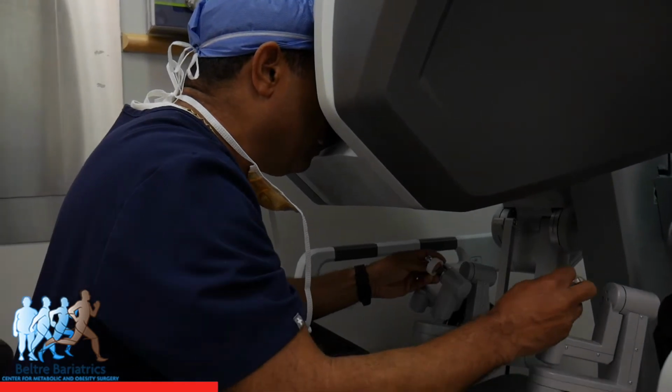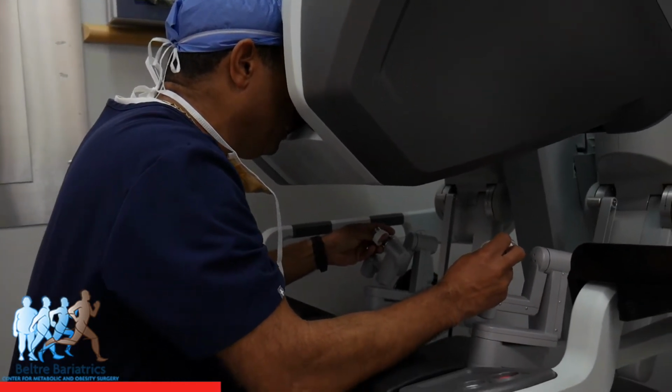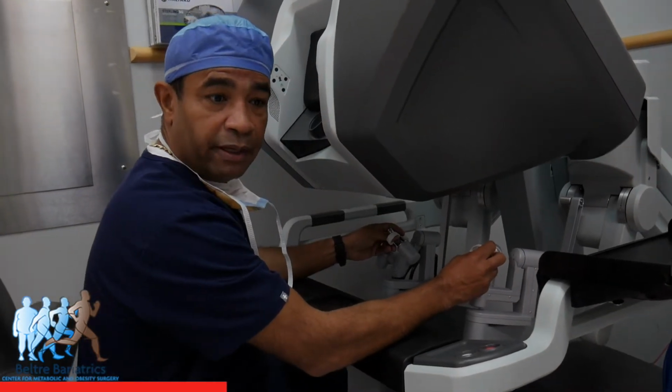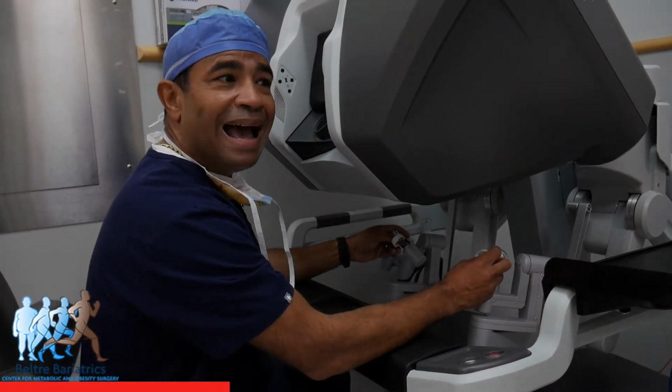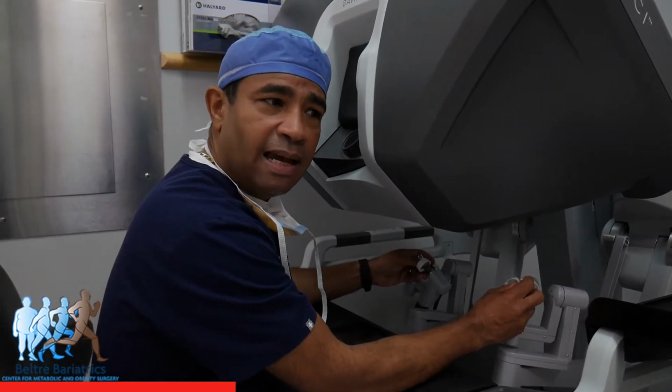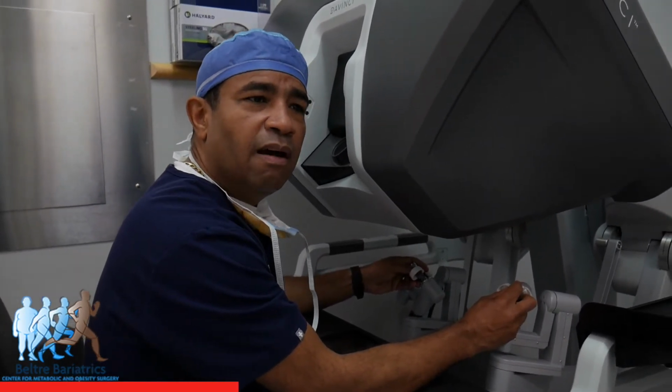When I'm operating, I'm like this, looking. And when I'm looking through here, it's actually a 3D picture, a 3D image. And it's like I'm literally inside the abdomen. It's an awesome view. Very defined.